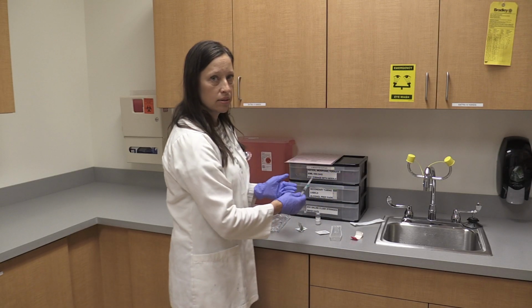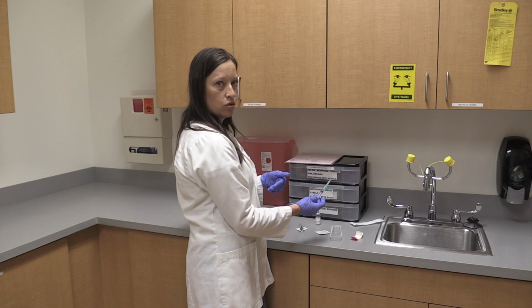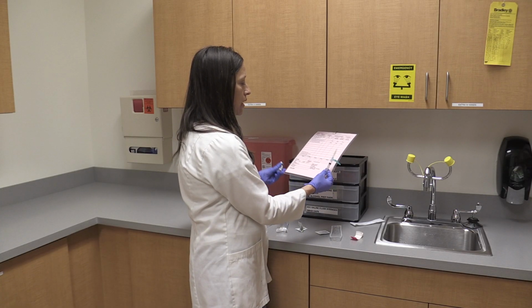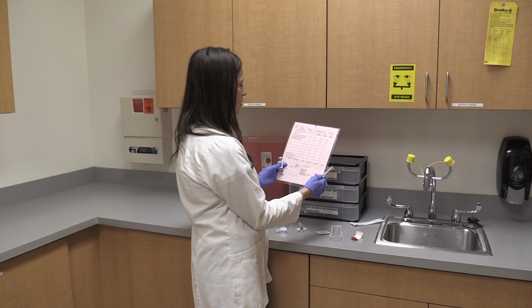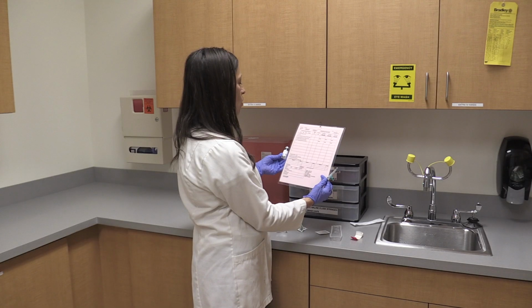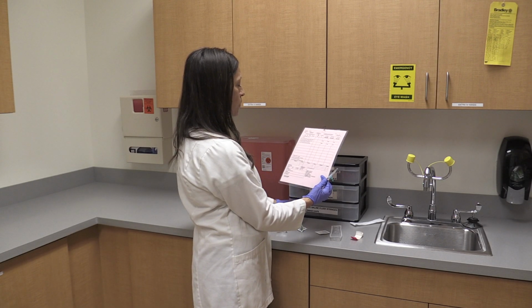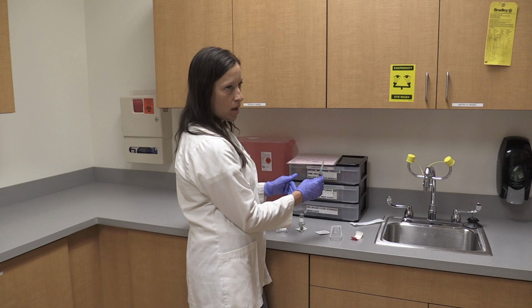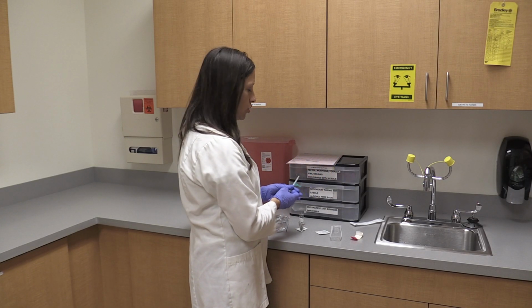And now I'm going to pause. So I want to pause and make sure that I have everything I need before I go to the patient's room. Again, pausing means taking your medication, your MAR, and your syringe, if you have that, to confirm that you have the correct thing. So morphine sulfate, 4 milligrams per ml. I'm supposed to give 2 milligrams IV push every 4 hours. So if it's 4 milligrams for 1 ml and I have 2 milligrams, then I need to have half an ml in my syringe, which I do.